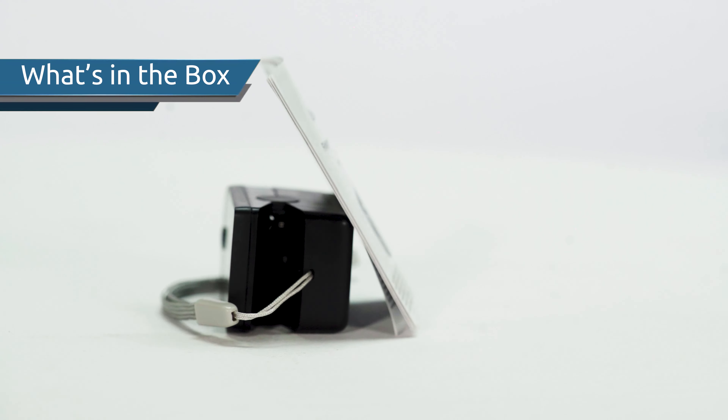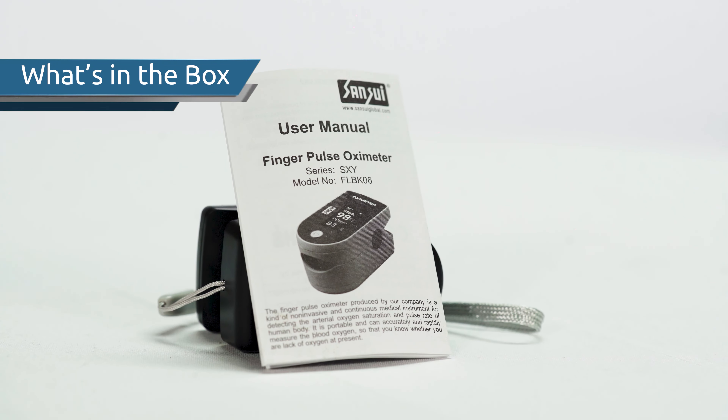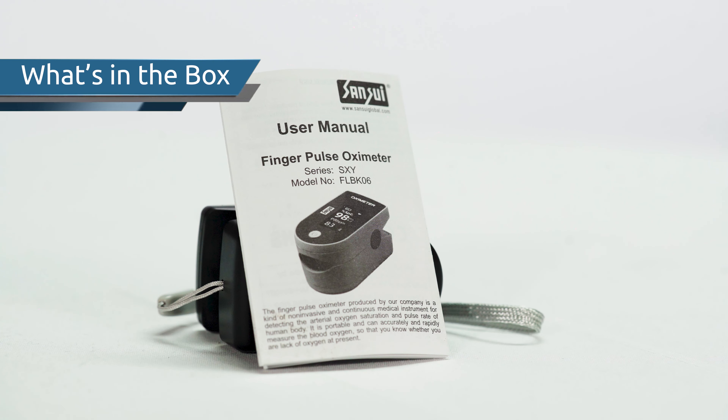With a newly purchased device, you will get one Sansui Black Pulse Oximeter, a lanyard, and a user manual.